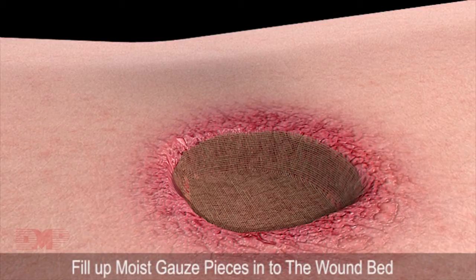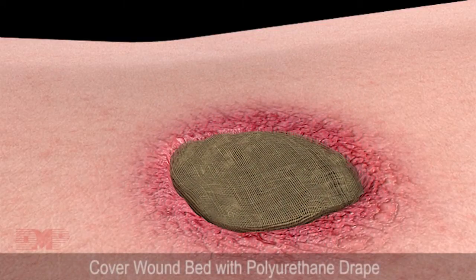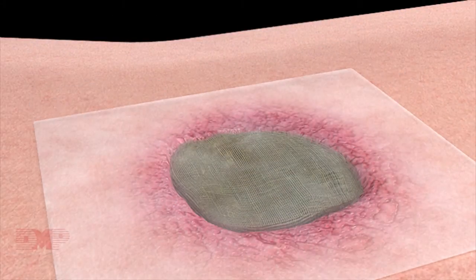Fill up moist gauze pieces into the wound bed. Cover the wound bed with polyurethane drape from approximately 3 to 5 cm from the border of intact skin. The PU drape is used to seal the wound bed and also protect the wound from external contamination.